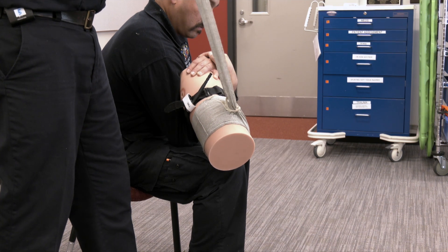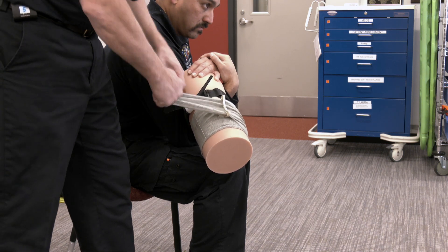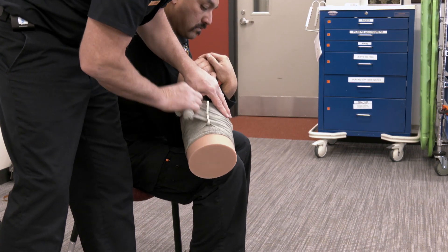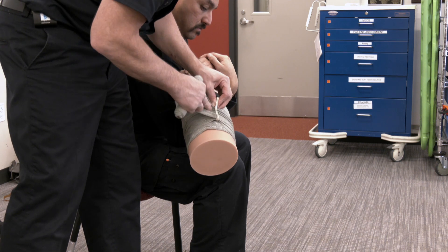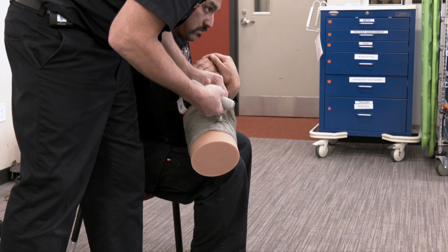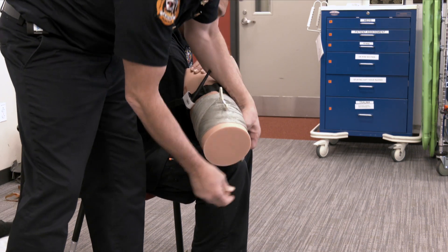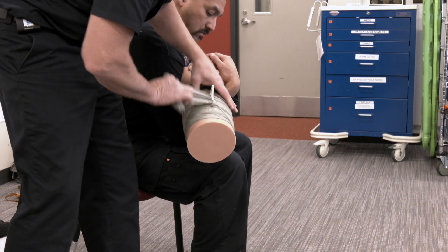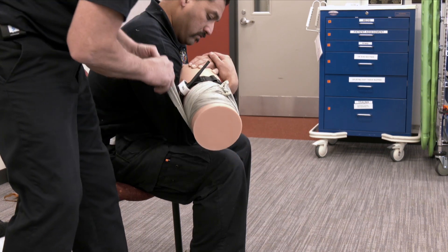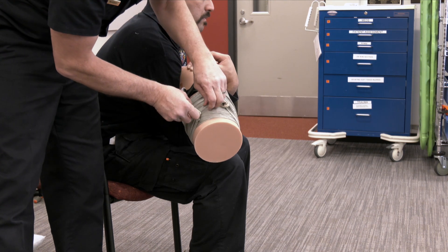There are several different ways to apply it — do what you need to do. You don't always have to use the pressure bar if you're applying direct pressure. I've seen people come in, go through the center, and hit on either side. This is the way they actually showed us in class — hit on either side, come back through, and that helps hold it so there's more surface area intact and it's not folding over as much. Then you finish up by wrapping around and using the little hook on the side to lock everything in.